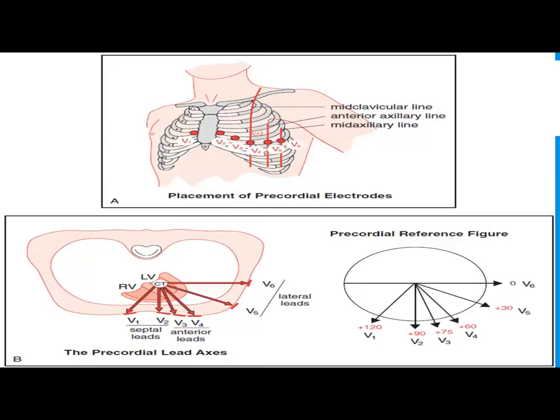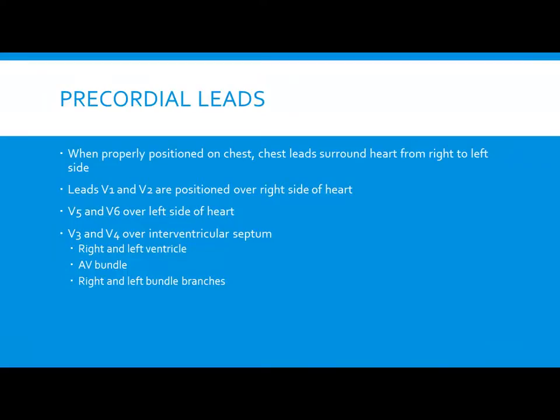As far as 12 lead goes, where we're sitting right now, all I care about you knowing is just really how to place it and how to place it correctly. Don't worry about studying up on axis deviation, all these different things. We got to learn the basics before we get to 12 lead. Don't worry about these plus, minus, and all that stuff for right now, okay? So when they're right, you should see a view from right to left of the heart, all right?